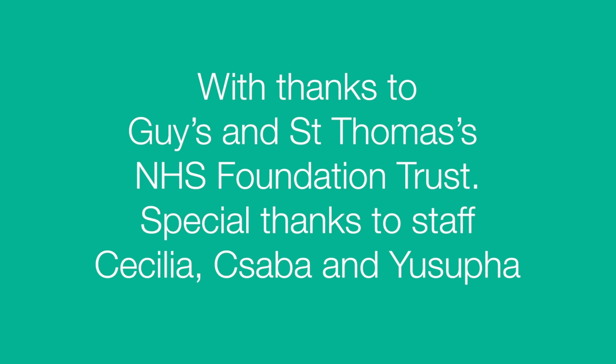With thanks to Guy's and St Thomas' NHS Foundation Trust. Special thanks to staff Cecilia, Chabba and Yusufa. Public Health England — protecting and improving the nation's health.